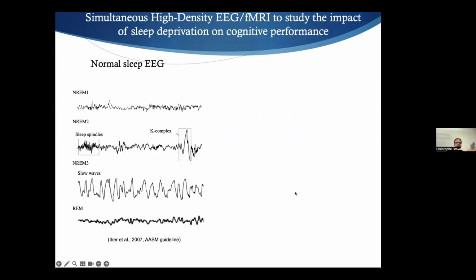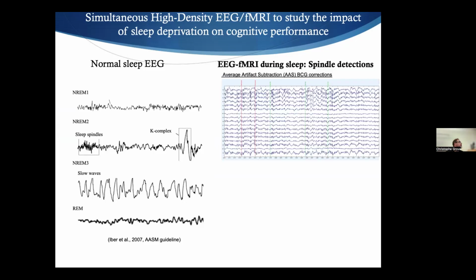And so in this study, a sleep study we did with Makoto, we were interested in measuring those spindles in the fMRI. What was really problematic is that the artifacts linked to the ballistocardiogram really overlap with the spindle frequency band. And that makes them quite complicated. I don't know if you see it here, but here you see some artifacts, and here you see what, according to the expert, has been considered as a spindle.